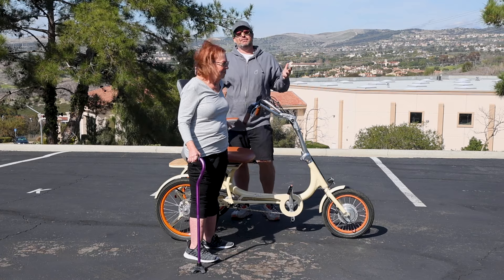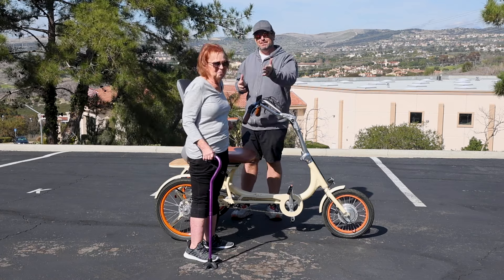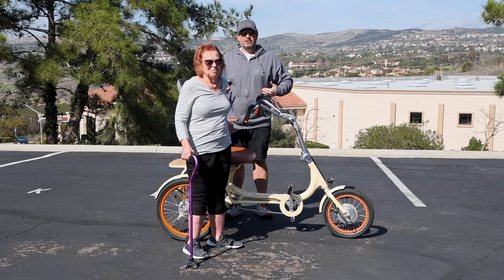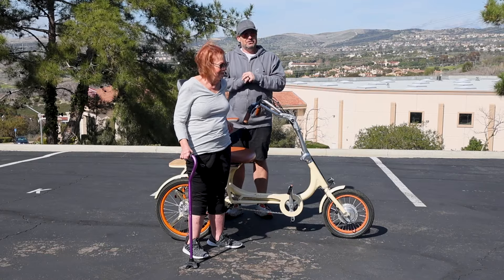Hey everyone, I'm Dustin. I have nearly 20 years of experience in the bike and e-bike industry. Today I have a special guest — my mom. She's in her 70s and has had some arthritis in her hips and knees, which has made walking more challenging as she's gotten older.